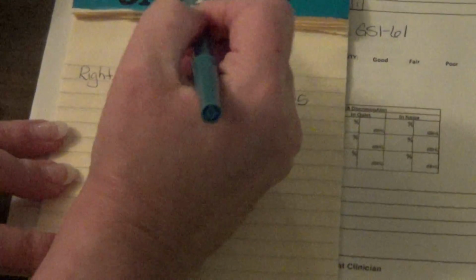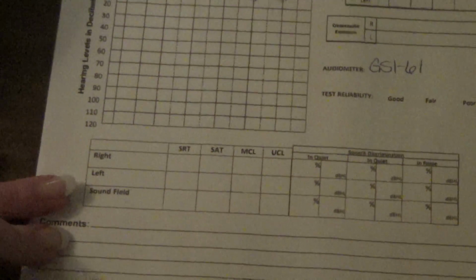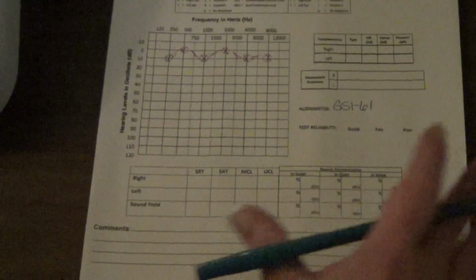That is the same for the left ear because the thresholds are the same. This information does not go anywhere on the audiogram. We just keep it aside so that we can correlate the two.